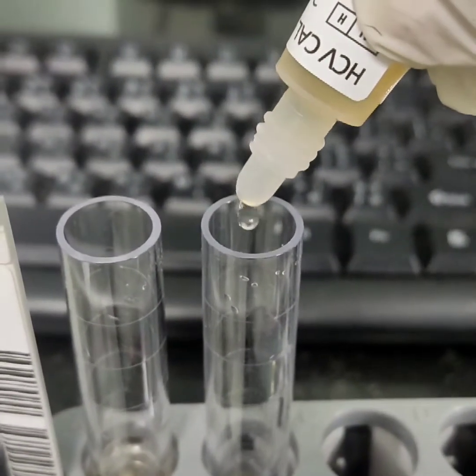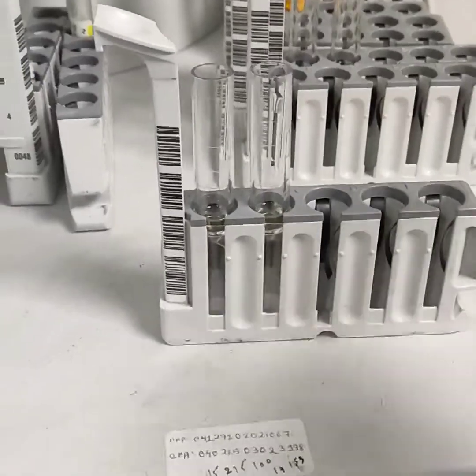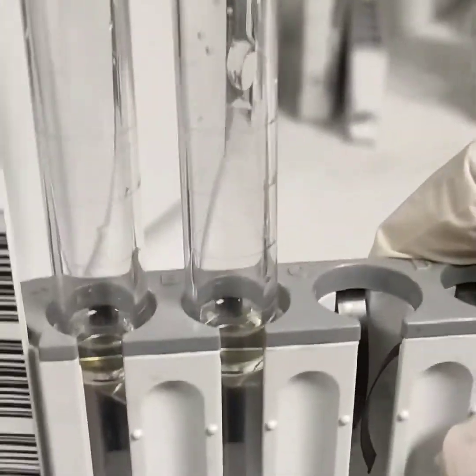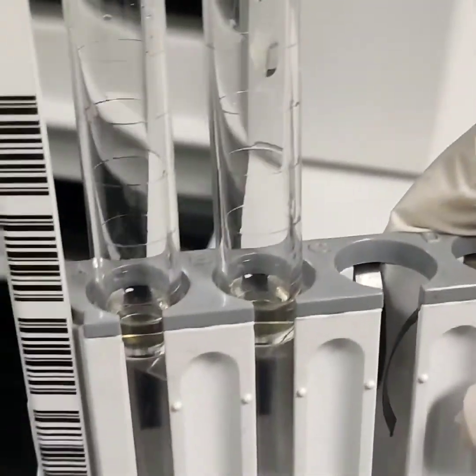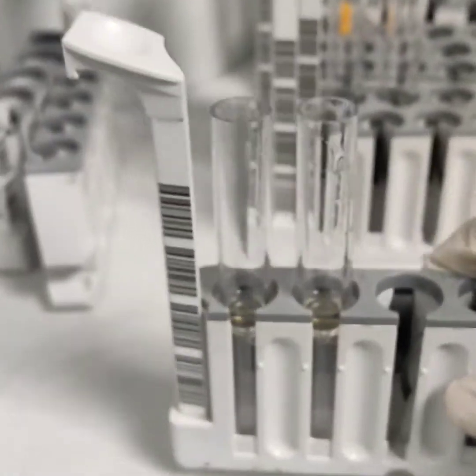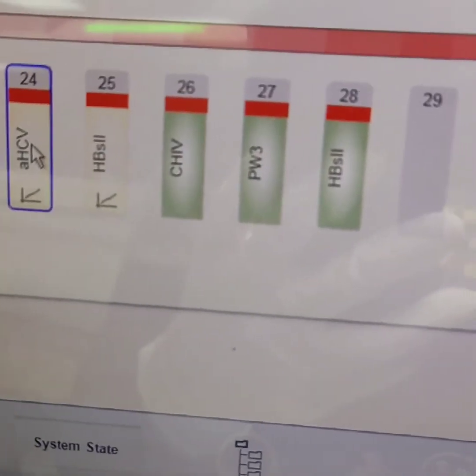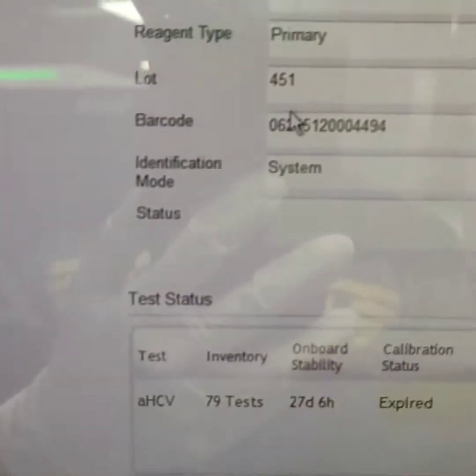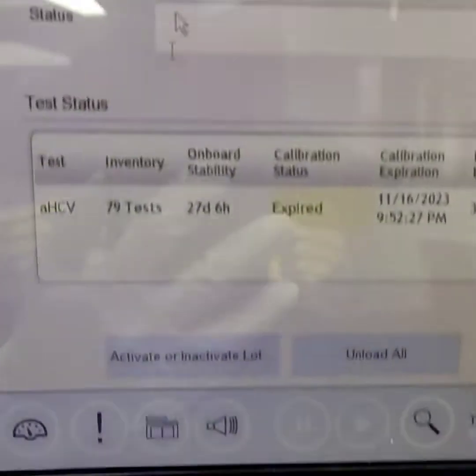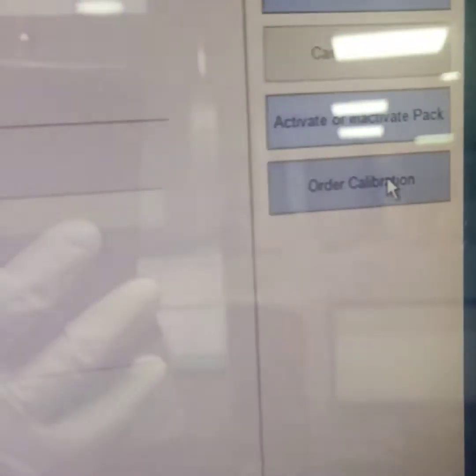The metrics are based on the high and low calibrator relative light units compared to those defined on the master curve. You can see the arrow sign, which means the reagent is not calibrated, so we go to order calibration.